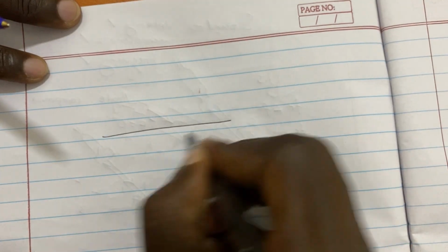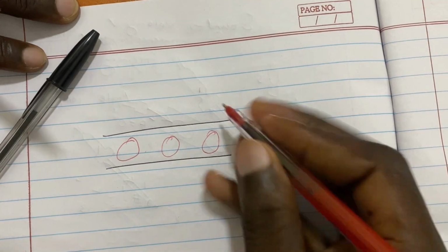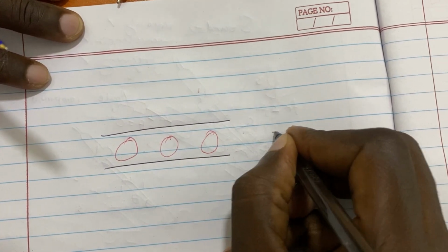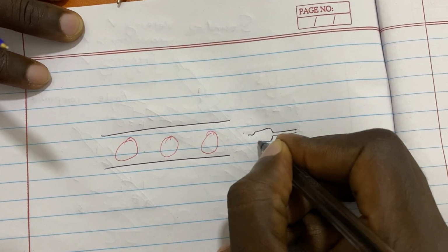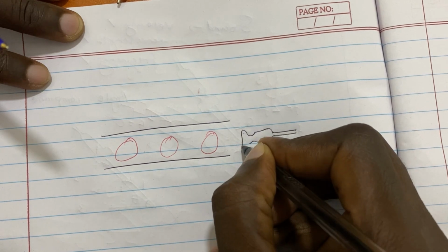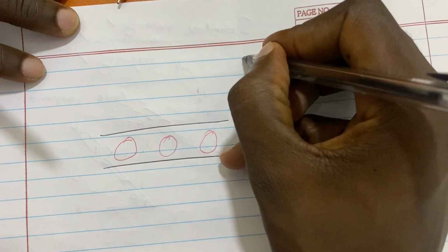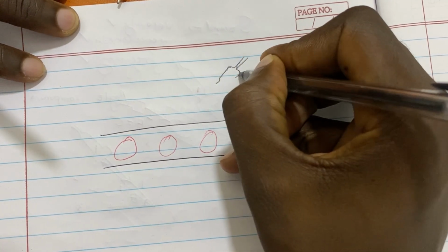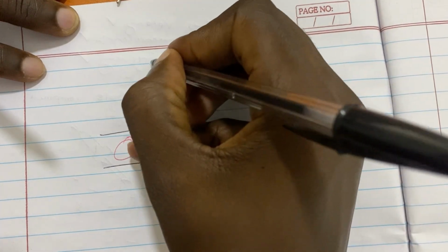If this is our blood vessel, we have blood cells inside, RBCs. If we decide to listen from here, to put it exactly parallel, this is our transducer. And then we decide also to put it here. This is our transducer. And we decide to put it here.